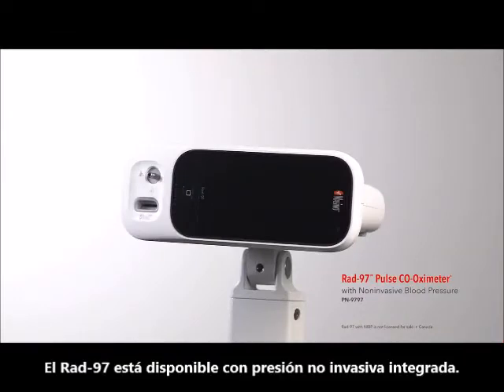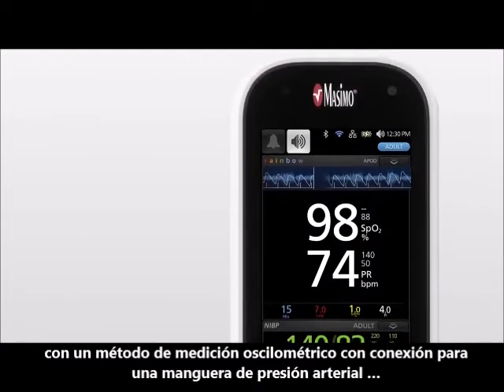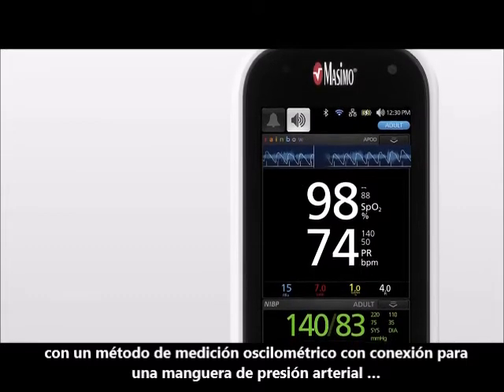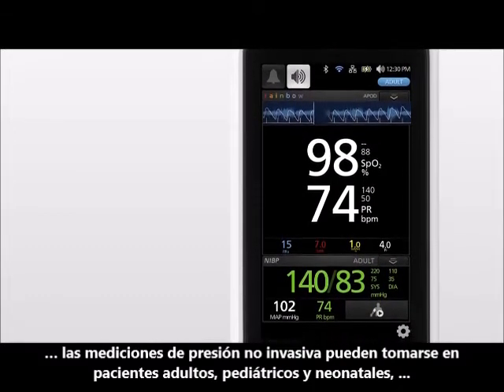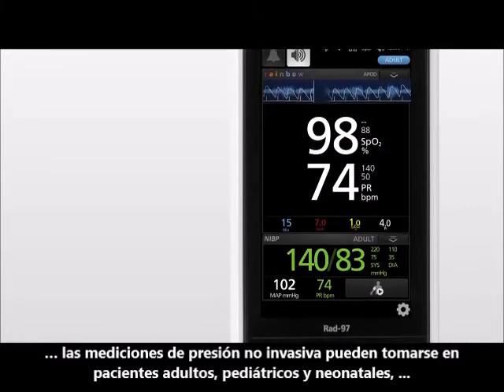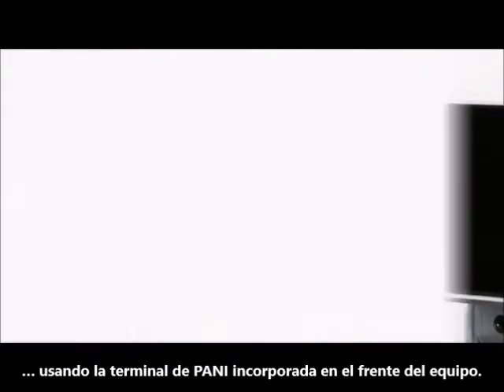The RAD97 Pulse Co-Oximeter is available with integrated non-invasive blood pressure, featuring an oscillometric method of measurement with a direct connection for a blood pressure hose. Non-invasive blood pressure readings can be taken for adult, pediatric, infant, and neonatal patients using a built-in NIBP nib on the front of the device.